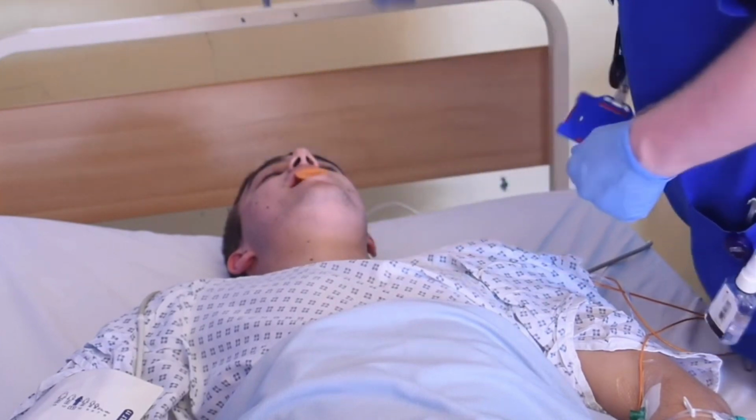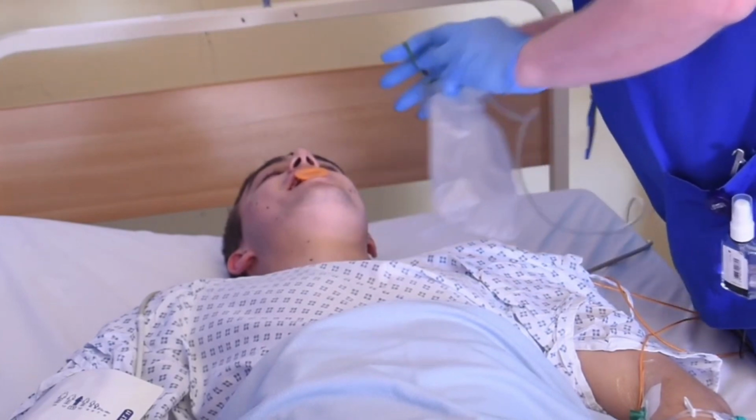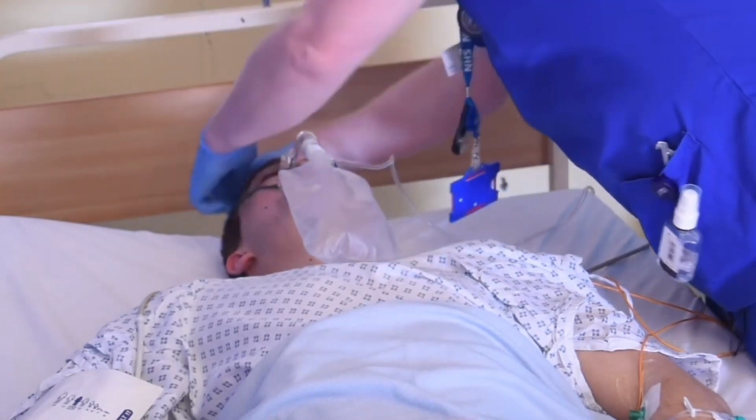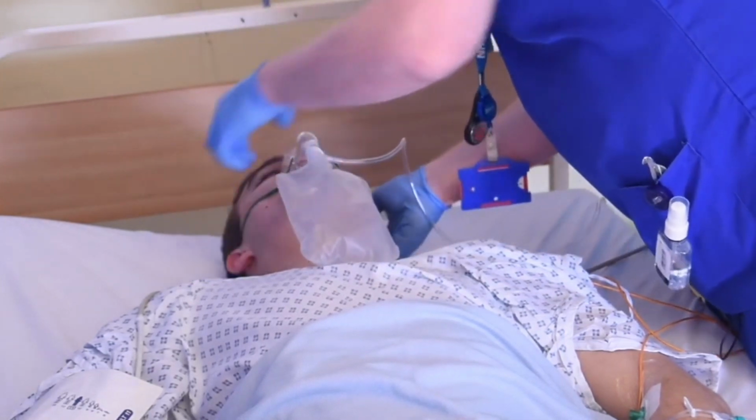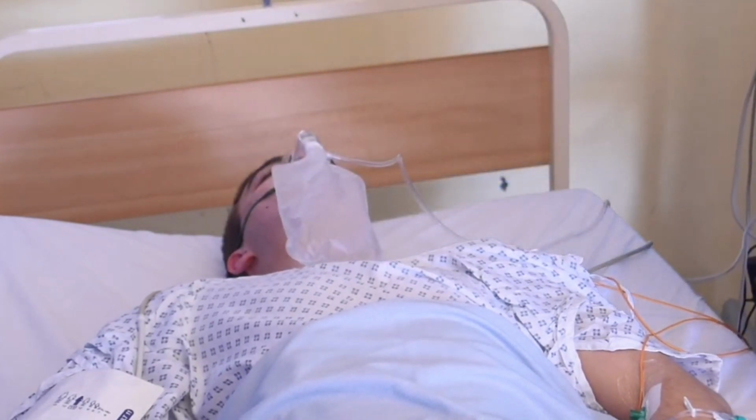If the patient resists, coughs, or gags during insertion of the OPA, or on reassessment appears to be spontaneously rejecting the device, it should be removed. Under no circumstances should force be applied to an OPA to keep it in place.